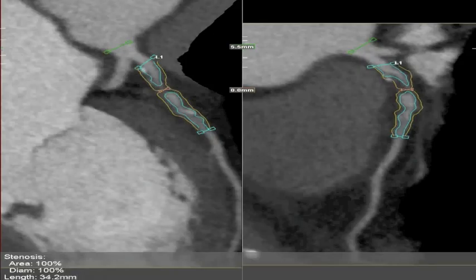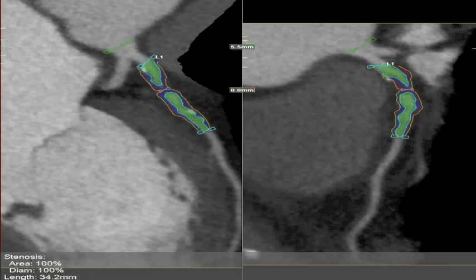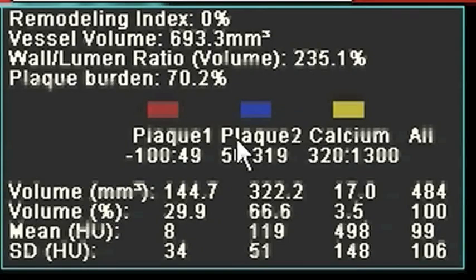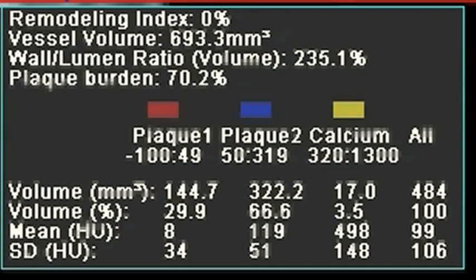In the LAD, the plaque measurement tool has done a better job now, even though it's not perfect. The volume of calcium in those two areas is 17 cubic millimeters. Adding that to the circumflex, we get a total of 30.5 cubic millimeters. Simply multiply that by 3 and we get an Agatston score of about 90, which compares reasonably well to the formal calcium score of 105.